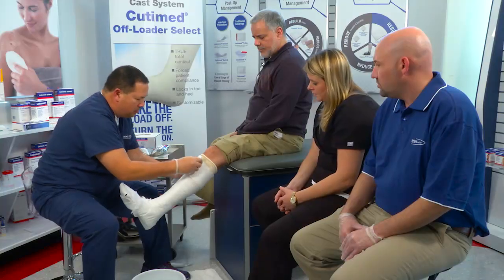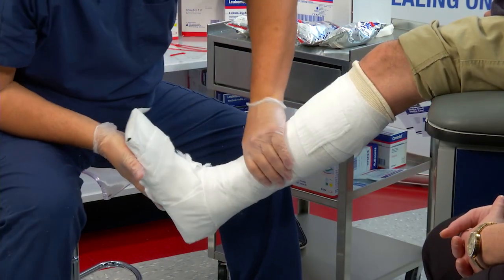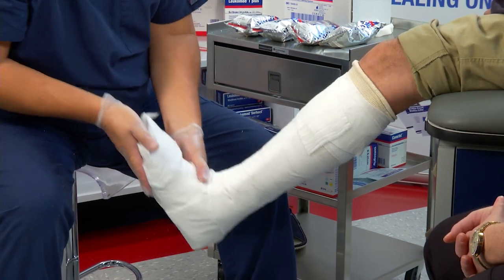I like to take that around there twice, just to rub this down so it's nice and smooth. You'll see how contoured it is to the skin.